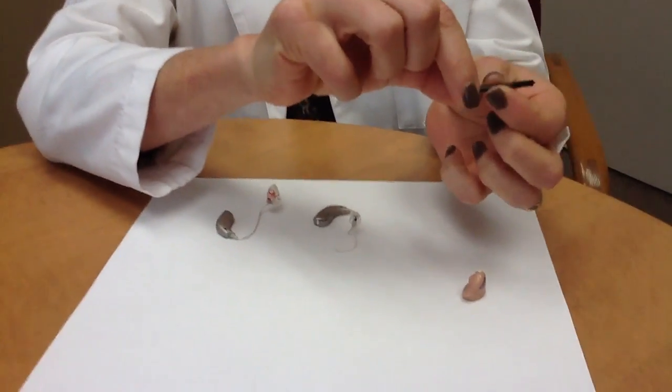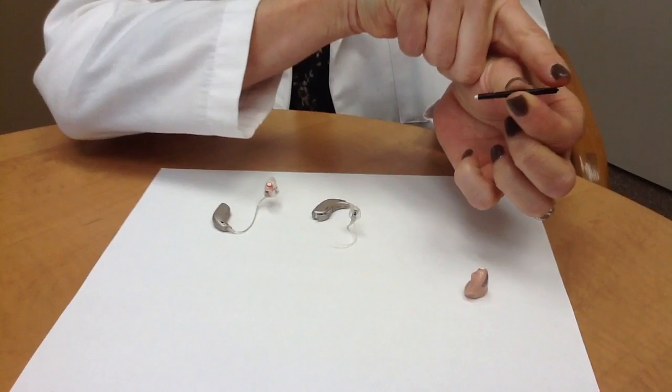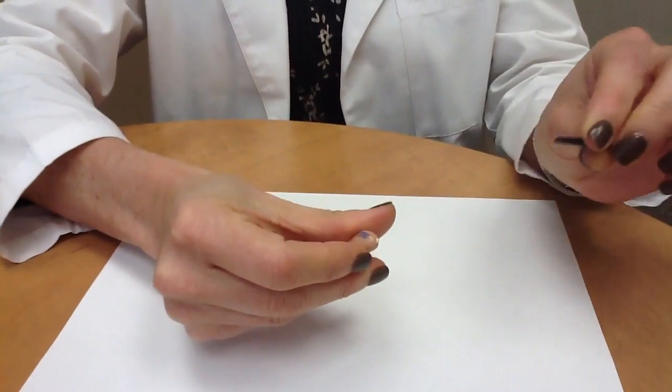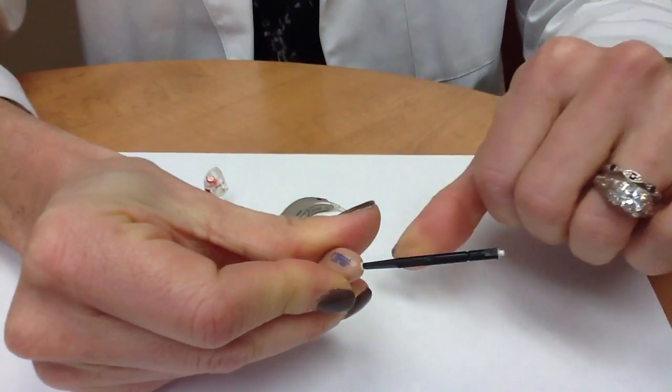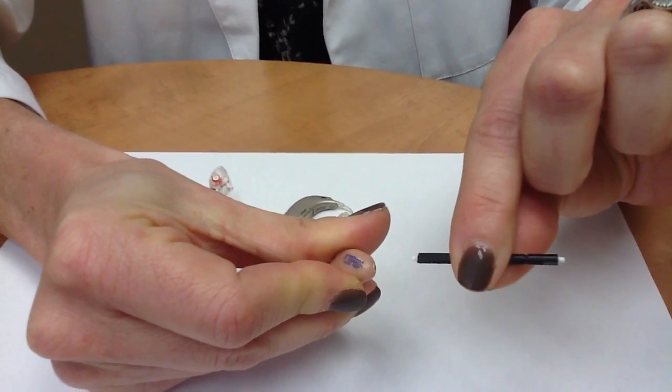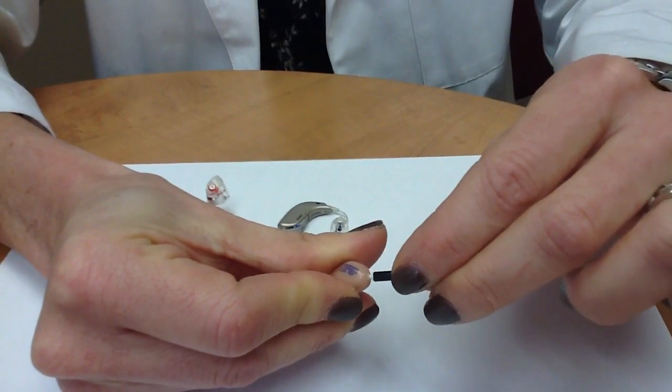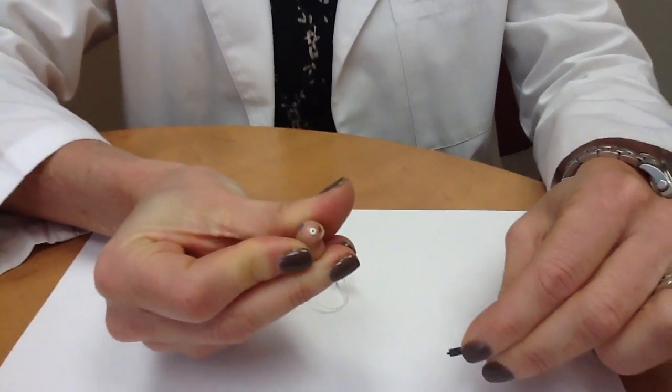Each new stick has a new wax guard on one side and a removal side on the other. To take the old one out, you simply put the removal side into the wax guard, give it a little twist, and it pulls out very easily. You then flip the wax guard over to a new one, line it up, simply push in and pull out, and it stays.